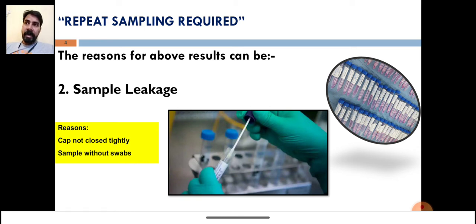While transporting, when the samples are received in our lab, we don't find any sample in the tube. This will lead to repeat sampling required because we cannot process an inadequate amount of sample in the vial. We need a specific amount of sample to start RNA extraction and do RT-PCR.